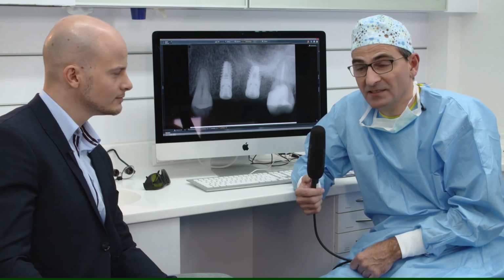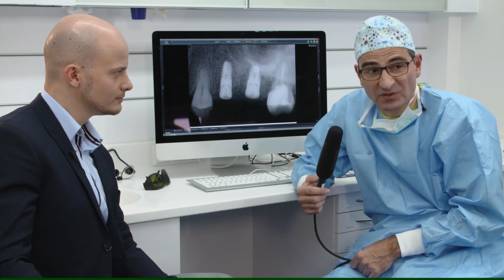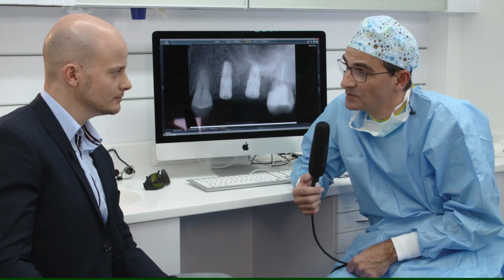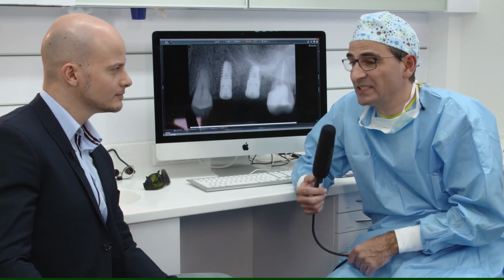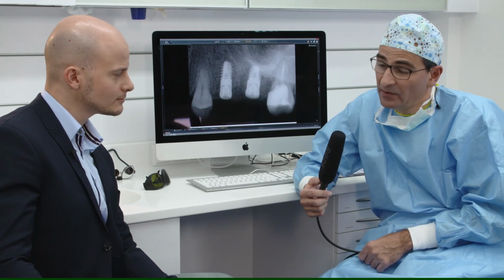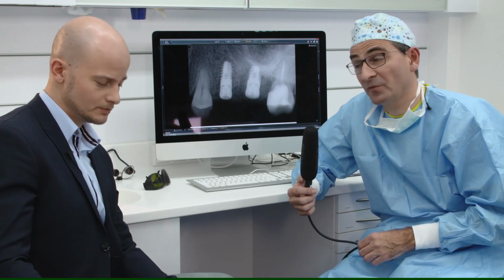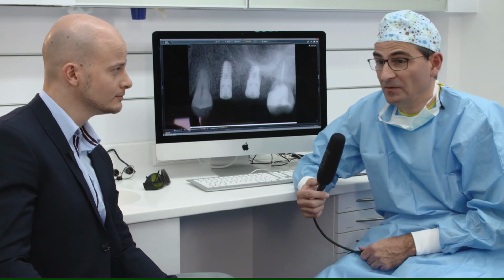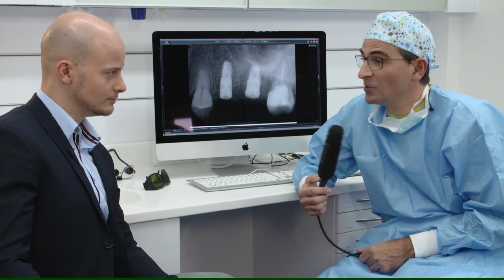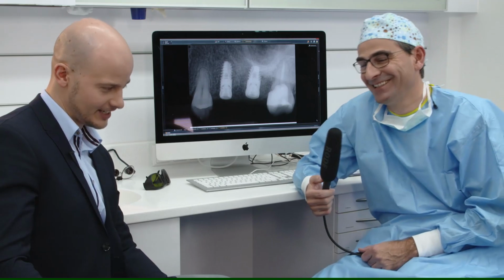So I think it's not a problem to take a 9.5 and not do a sinus elevation in this case. We talked about this because the patient was a little bit anxious. She said she wanted a shorter implant, and 9.5 isn't that short because the diameter is 4.5. And she told me that if I lose it, then you can also do the sinus floor elevation.